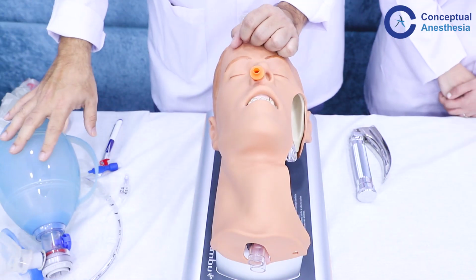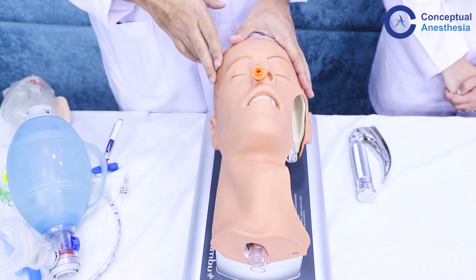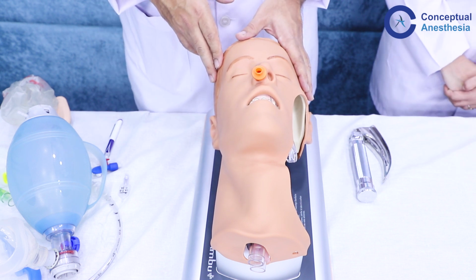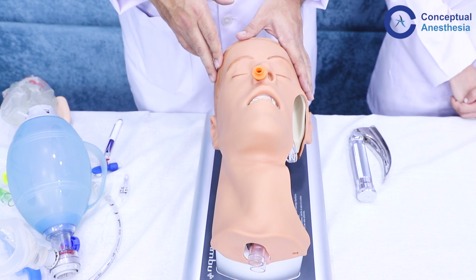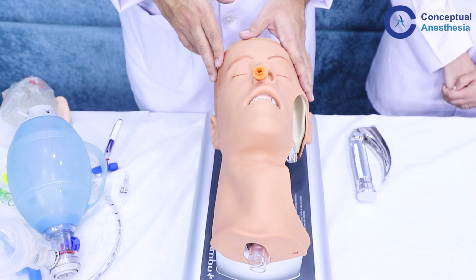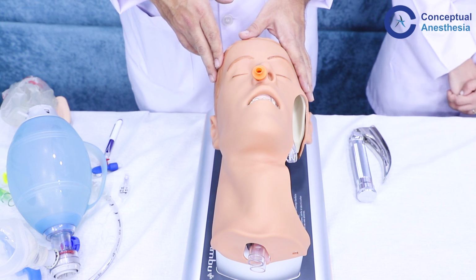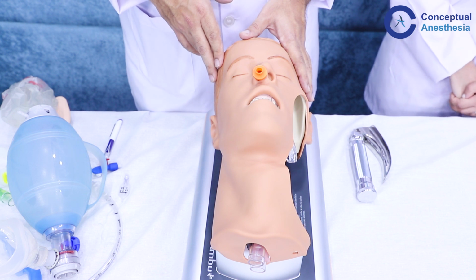So when a person becomes unconscious, the most common structure to obstruct the airway is the base of the tongue. So when the base of tongue touches the posterior pharyngeal wall, the airway closes. So both of these gadgets, the oropharyngeal airway as well as the nasopharyngeal airway, help us open the airway. And where we have to use them is individualized. So if a person is unconscious but has a gag reflex, we will use the nasopharyngeal airway. But if he is unconscious and he does not have a gag reflex, we can use the oropharyngeal airway.